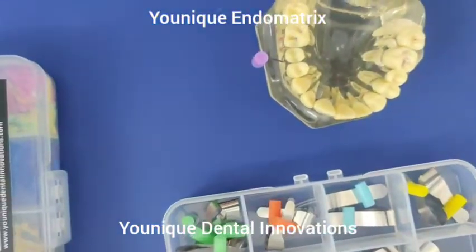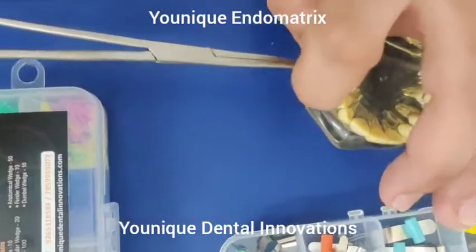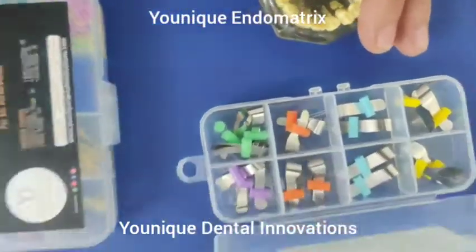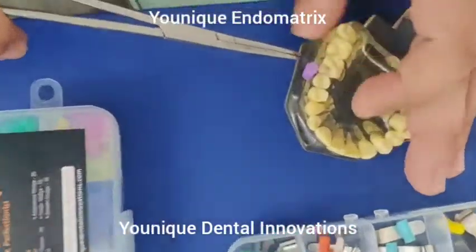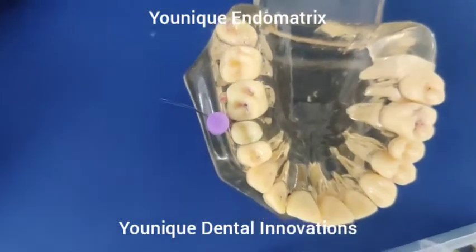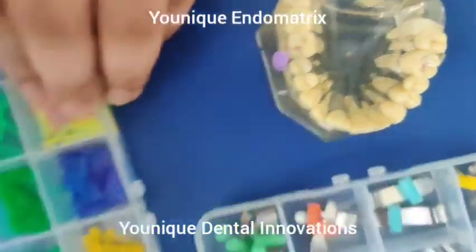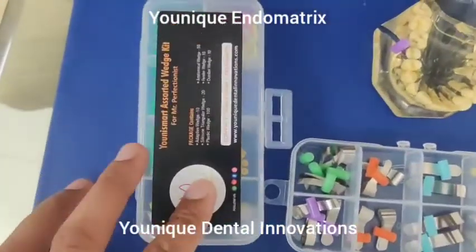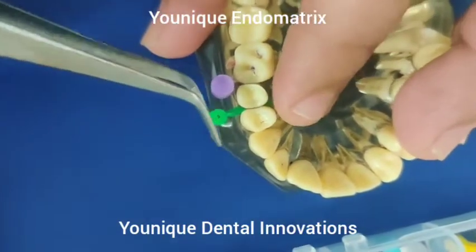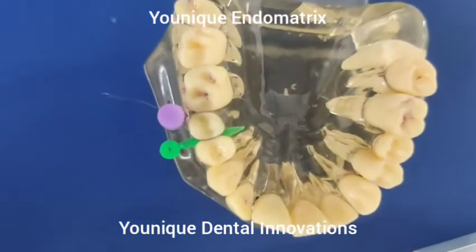Then take artery forceps and tighten it according to our need, and tighten it in any one corner of our tooth. So it's ready to build up. If you want to tighten more from the gingival side, then we have to use our wedge. Now I am using this wedge here. Yeah. Now it's perfect and ready for filling.